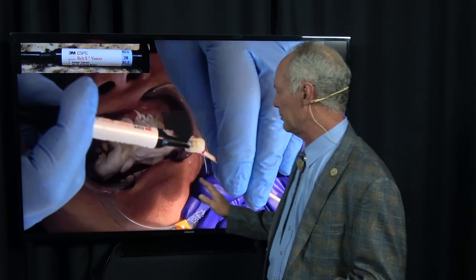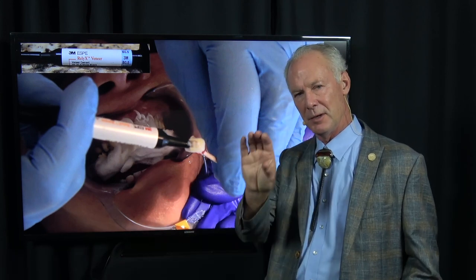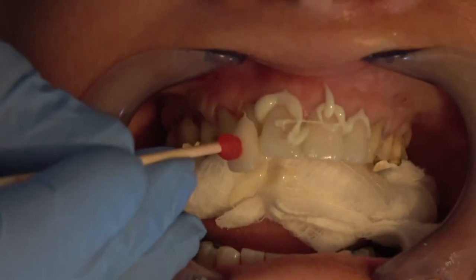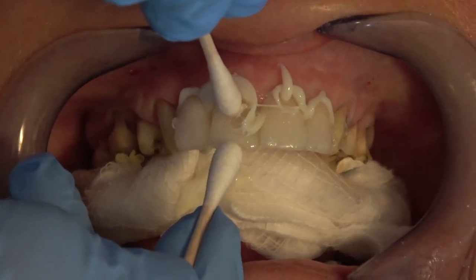If you come in and out of the luting composite with the tip, you'll incorporate an air bubble and you'll have a gray spot on your veneer. So you've got to keep the tip in the luting composite as you squirt it into the tooth side of the veneer. Always put them all on at one time - don't put them on one at a time. If you put the veneers on one at a time and cure, you've got to remove excess luting composite before seating the adjacent veneer, which causes gingival bleeding. Put them all on at the same time and you know the interproximal contacts are right.